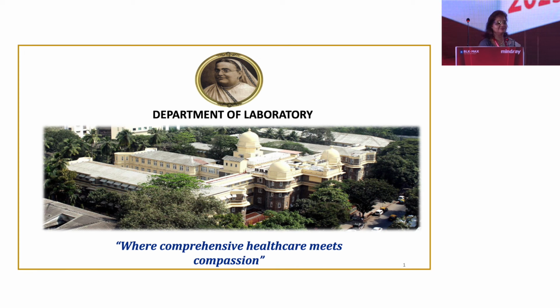My study is based on a different kind of population. It's on newborns, mainly neonates. And this request came at the same PRBC conference. One of the neonatologists asked me, I need the IT ratio. How can you report it to me, and how should I send the request? Then I said, let me study. It should not be a big problem because we have hematology analyzers which are capable of reporting so many parameters.